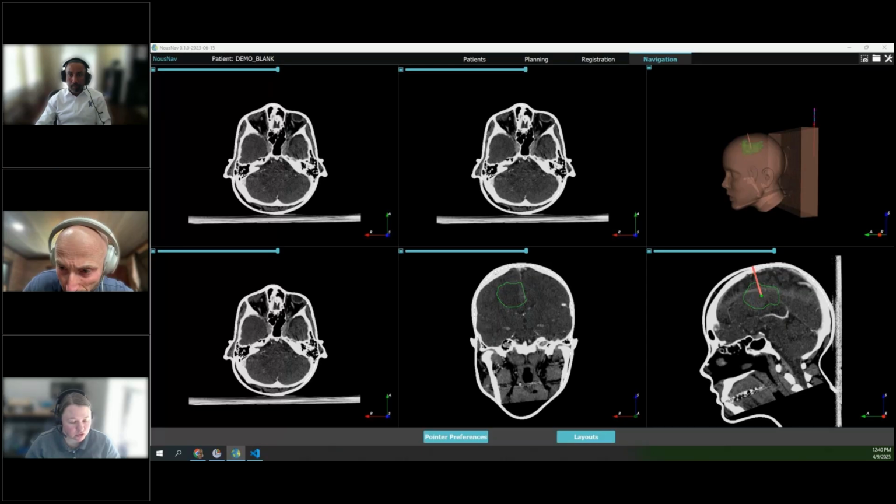That is a joint effort between us here at Kitware and the folks at BWH to continue the development so it can be an FDA approved tool and to do all the documentation. We are actively doing that work, and it's being done in part by us.